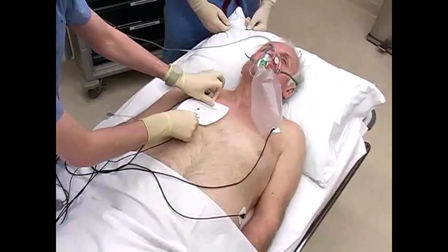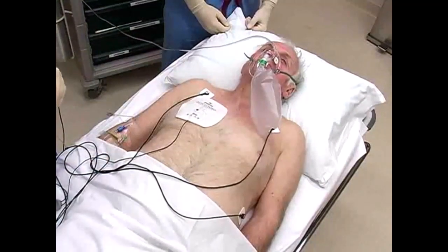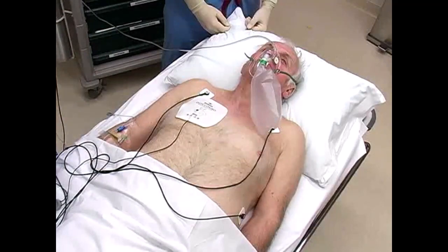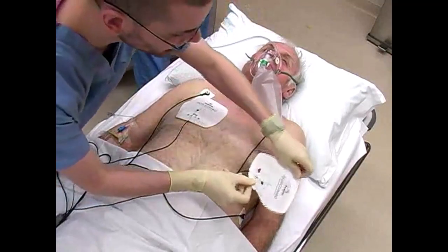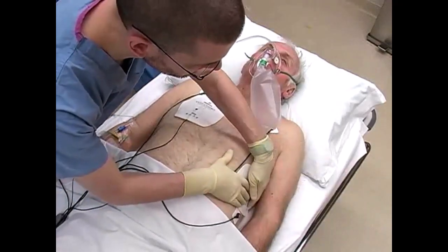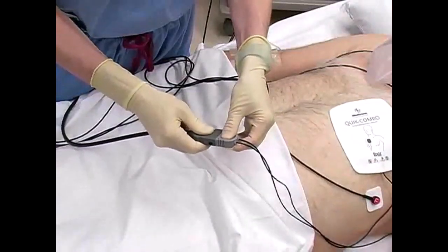Anterior-lateral positioning may alternatively be used. Place the anterior pad to the right of the sternal margin at the second or third intercostal space and the lateral pad in the left mid-axillary line at the fourth or fifth intercostal space. Attach the cables from the defibrillation pads to the monitor cable.